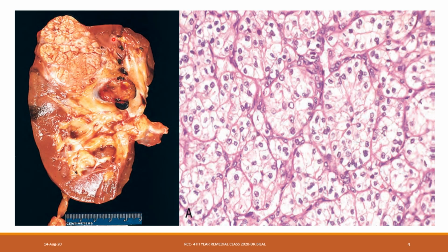This here is the tumor, this is the normal kidney, and there's a sharp demarcation, and this is a circumscribed tumor. At least on gross inspection, it is not invading into the surrounding normal kidney in this region or this region or this region. So it is a round circumscribed thing you see here, predominantly in the cortical region and extending into the medullary region of the kidney.